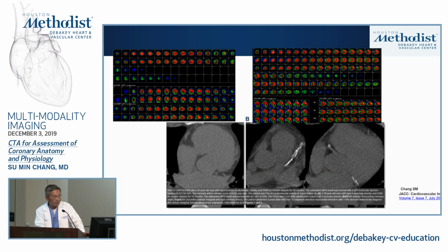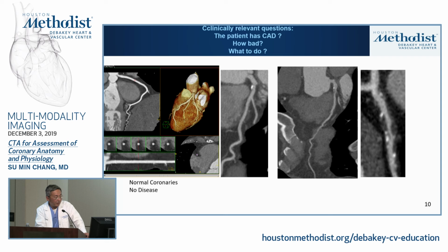So essentially, hopefully, like Dr. Harvey Heck says, when you go through the airport with the X-ray screening, ideally someday after you go through, they give you a little piece of paper saying what your calcium score is. I think that would be good.